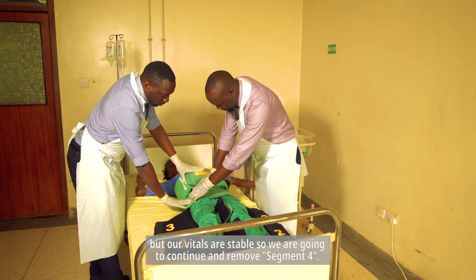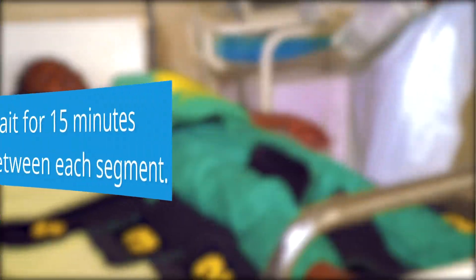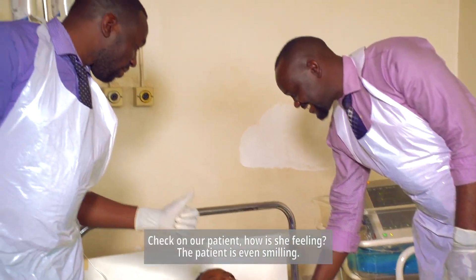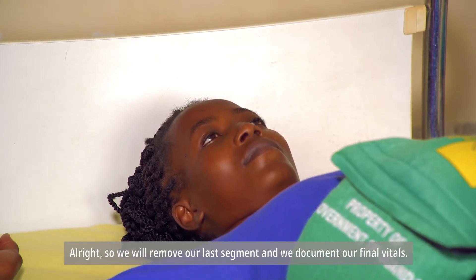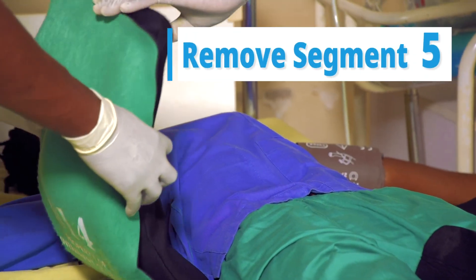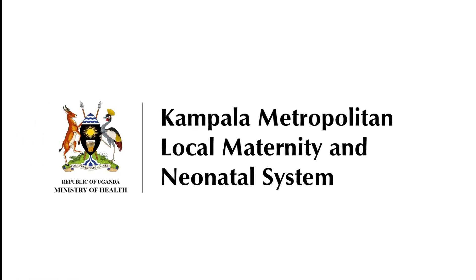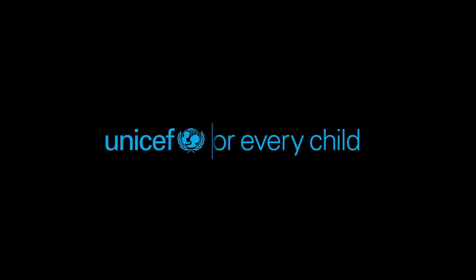We remove segment four, wait another 15 minutes for redistribution, then take the vitals again. We check on our patient — she is even smiling. We remove our last segment and document our final vitals. The uterus is well contracted.